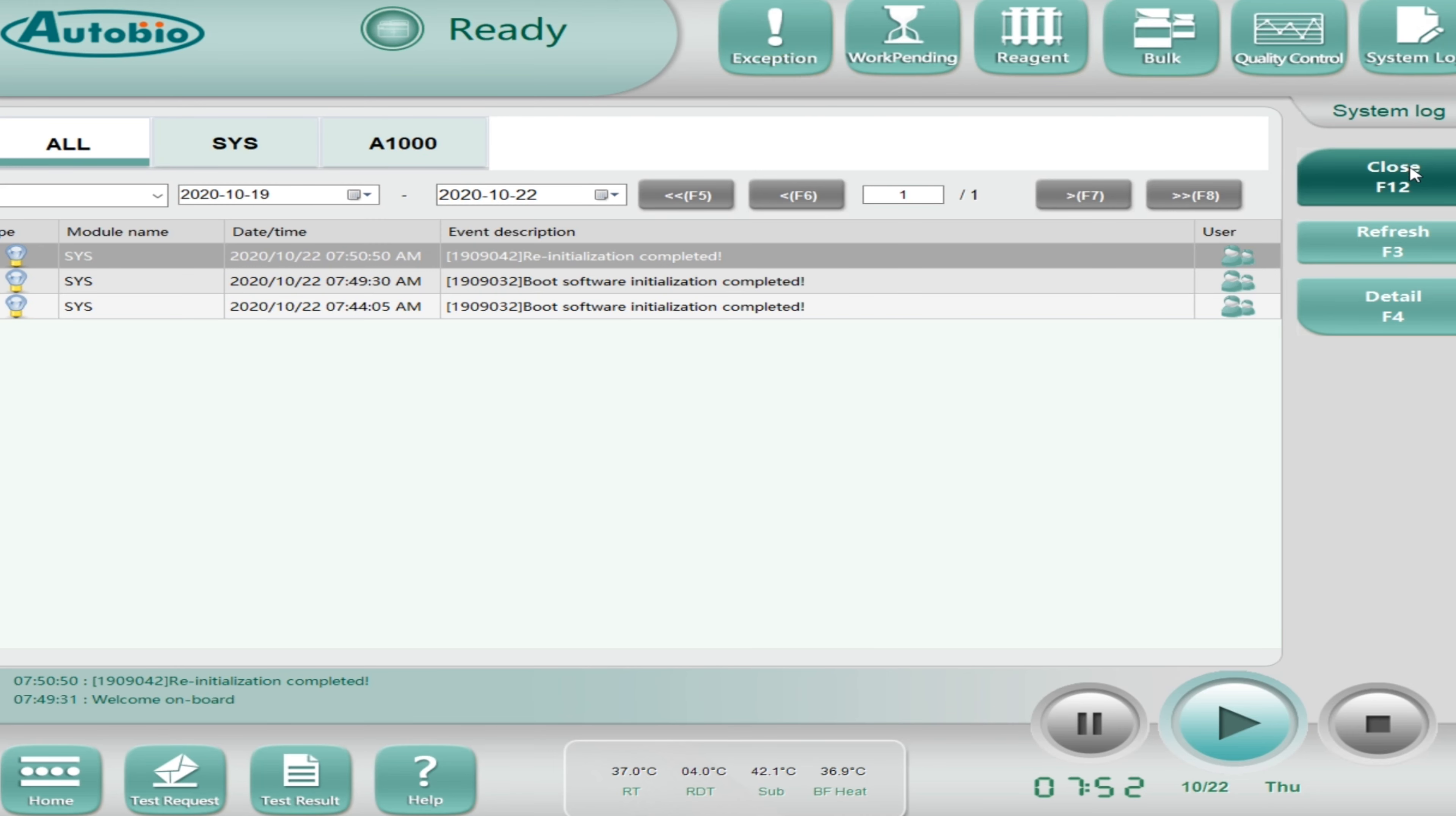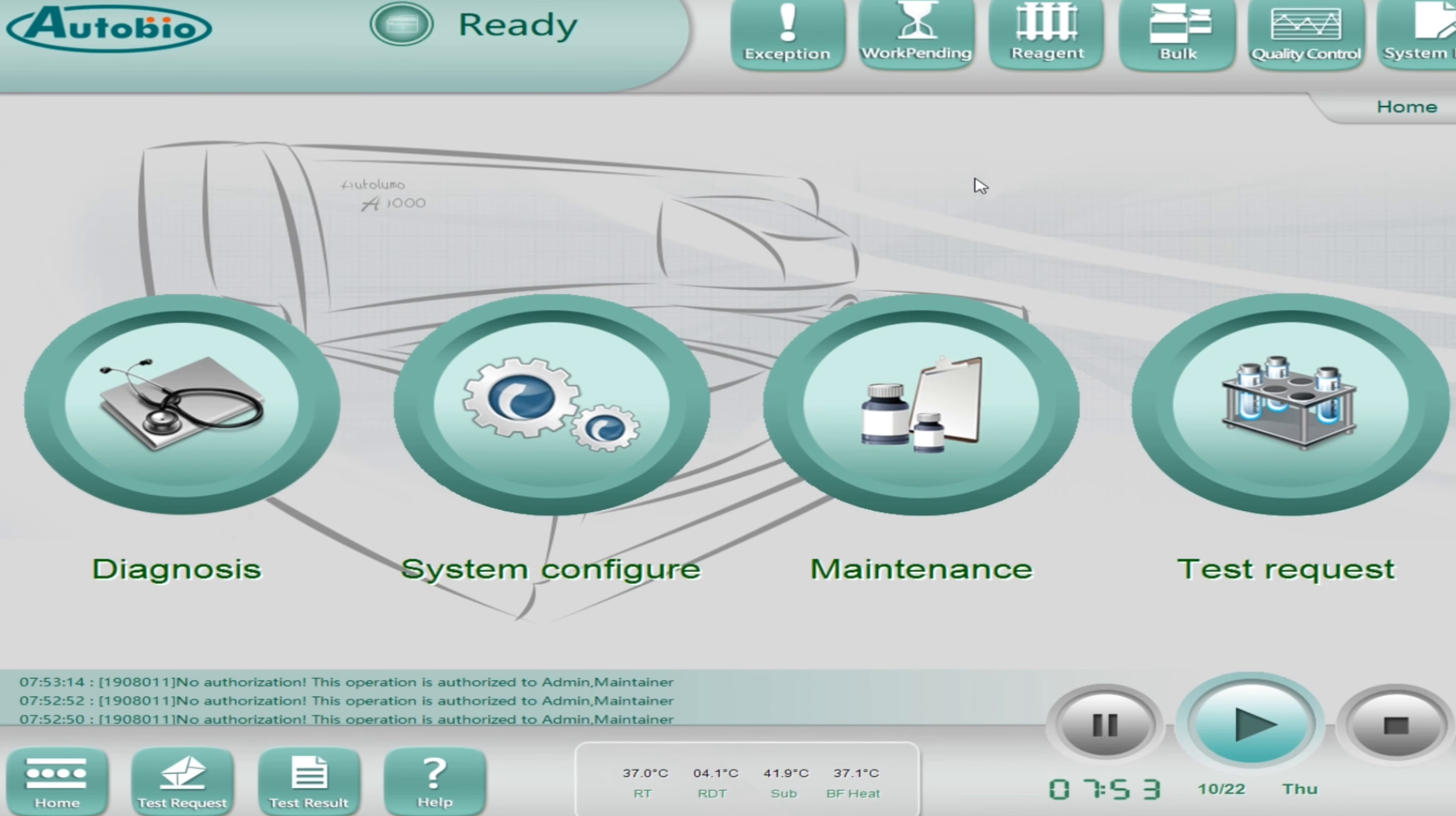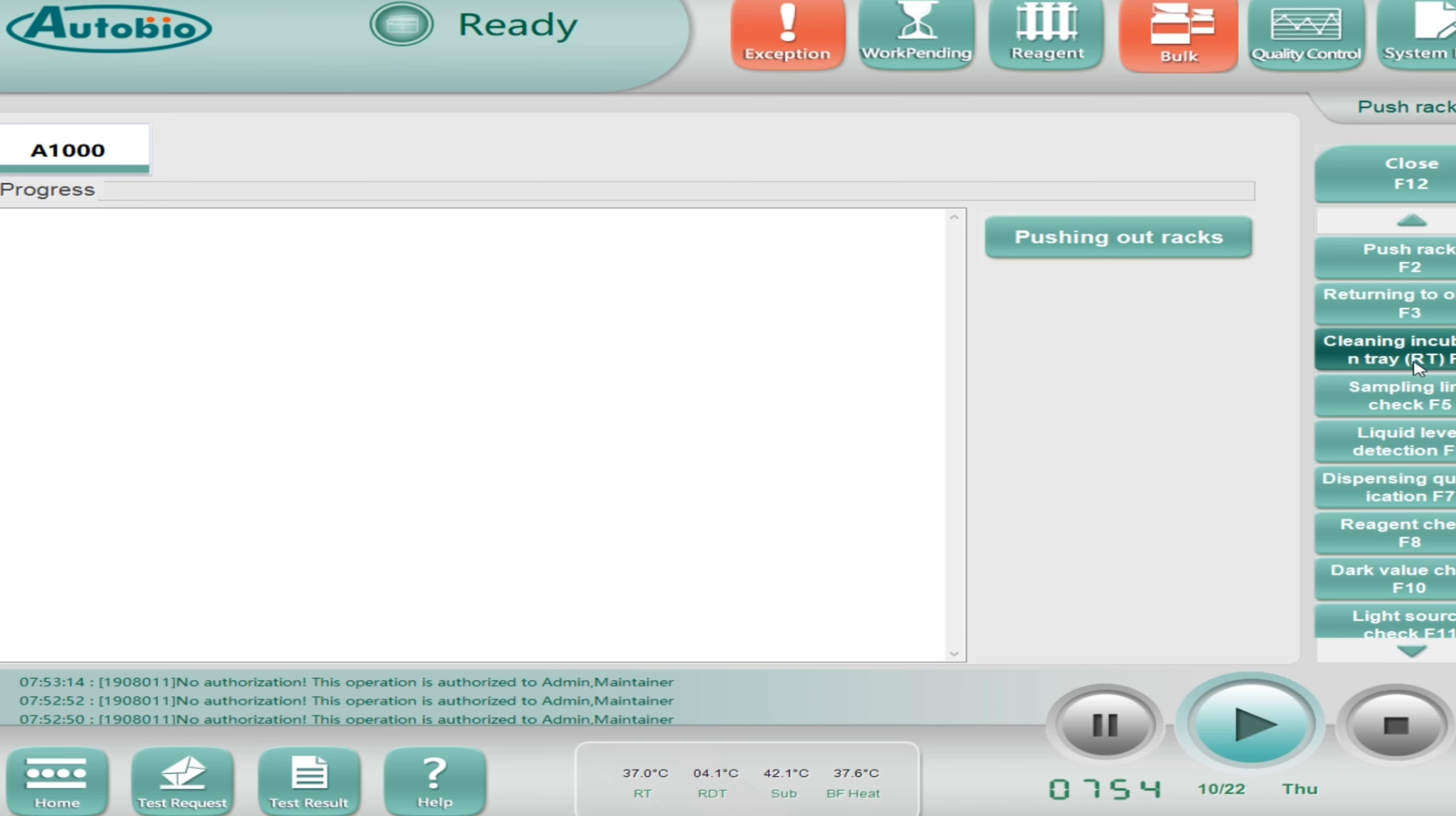Let's come to the next which is reagent. Here you can see which reagents are on board, which is already loaded there. It will also show you the remaining number of tests and also the on board stability of the reagents.